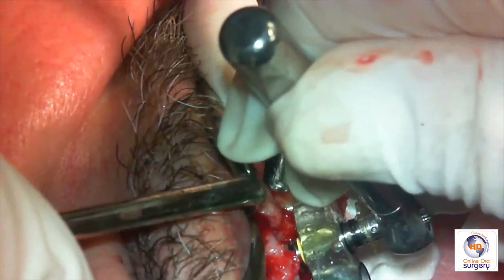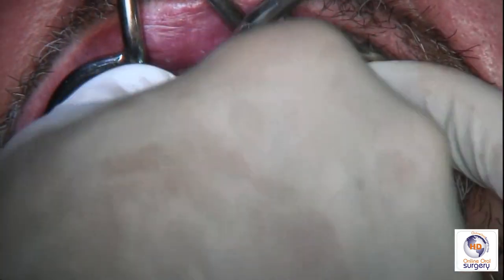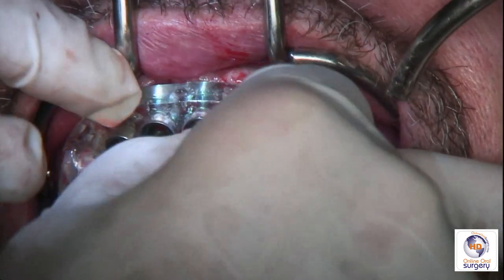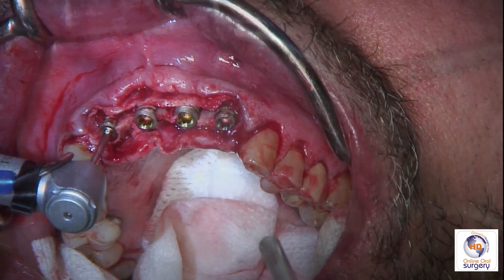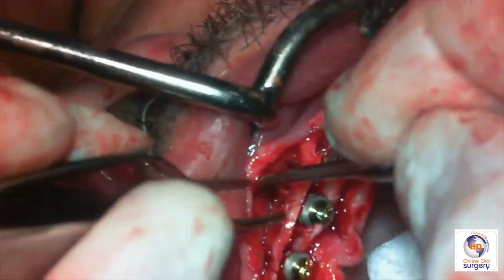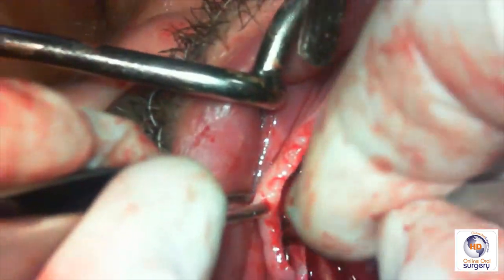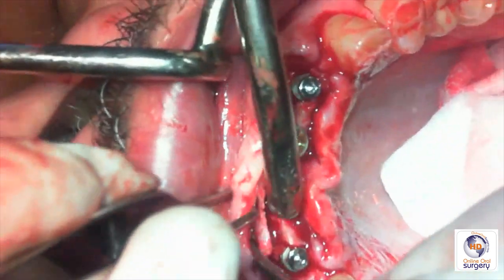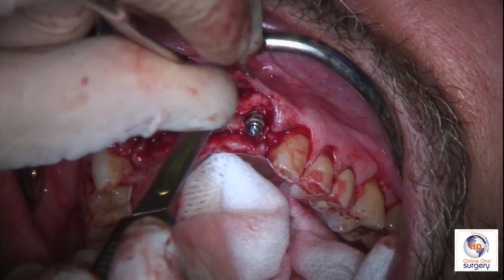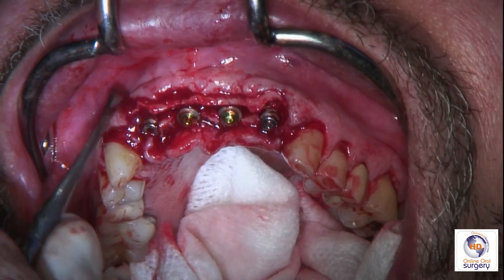And then we remove the handpiece and use a hand torque wrench in order to adjust the timing of the fixture once it's to depth. We're going to remove all the implant mounts and then place cover screws on all four of the implants, and then go back and I'm going to release the periosteum off of the buccal cortex as much as I can to be able to get primary closure, or as close to primary closure as I can without tension. And I'm going to score the periosteum using a number 15 scalpel blade.